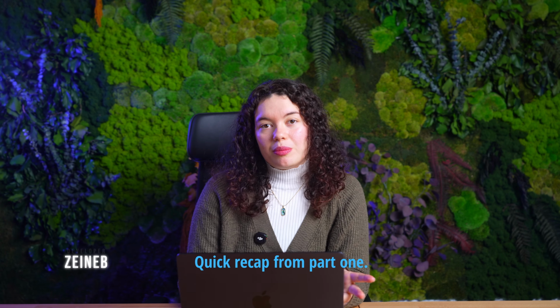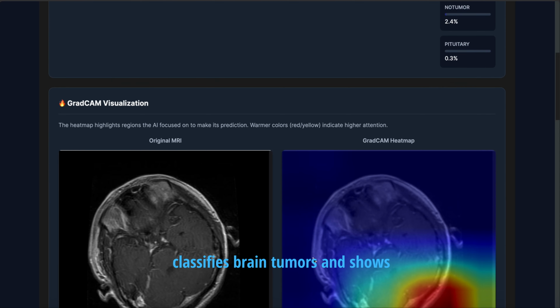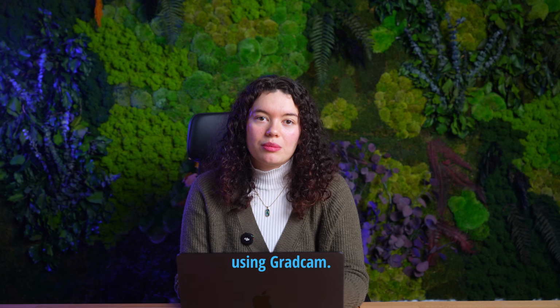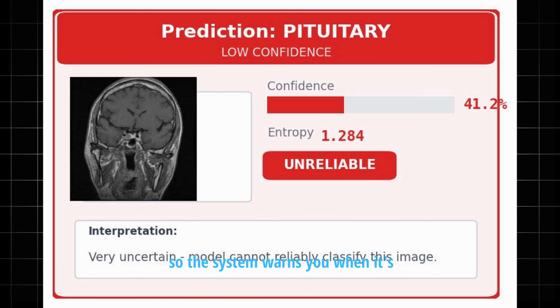Quick recap from part 1. AutoScanAI takes MRI scans, classifies brain tumors, and shows where the model is looking using GradCam. It also includes uncertainty handling, so the system warns you when it's not confident.